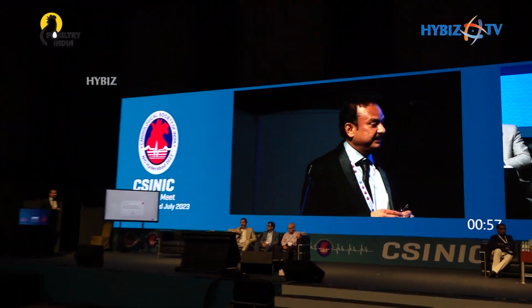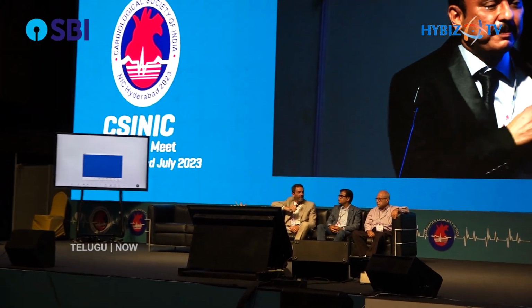Yeah, thank you. Very nice lecture. We learned a lot. I think that imaging can help us in taking the right decision. But I have a specific question. You very fast mentioned that with SCAD, there is also the risk of worsening the SCAD itself with OCT. Obviously, if we have a clear diagnosis by the angio, it's enough. But sometimes we have some doubts and we need imaging. So can you suggest when we should use OCT and when we should not use OCT for the final diagnosis of SCAD?